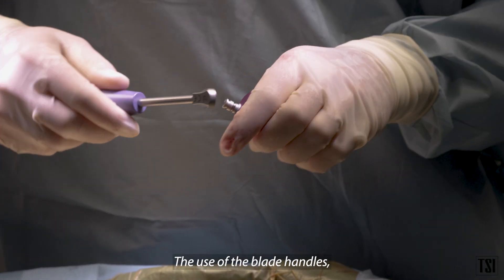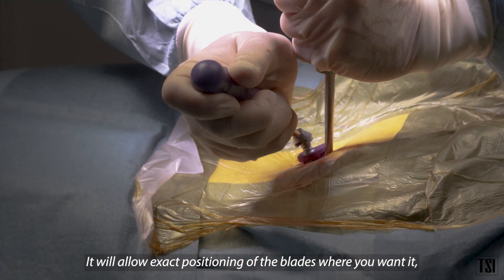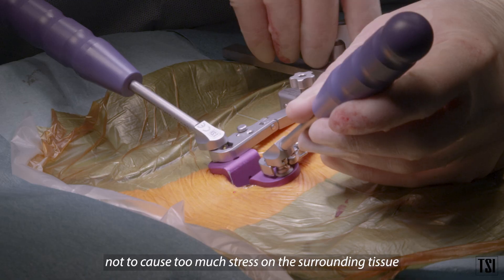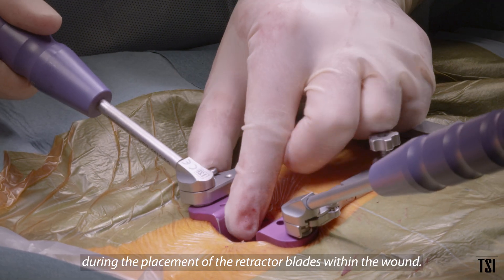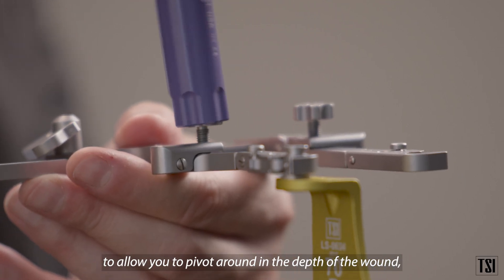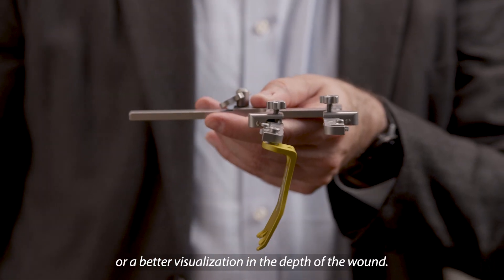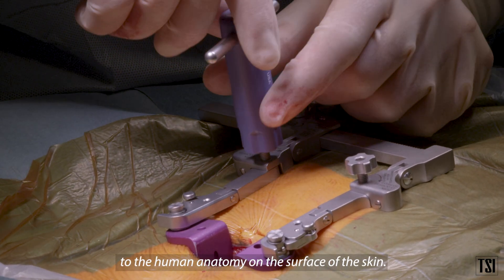The blade handles are extremely easy to position into the wound. They allow exact positioning of the blades where you want them and reduce stress and damage to the surrounding tissue during placement of the retractor blades within the wound. The versatility of the retractor is extremely important — it allows you to pivot in the depth of the wound for maximum access and better visualization. The hinges of the spinal retractor allow it to conform to human anatomy on the surface of the skin.